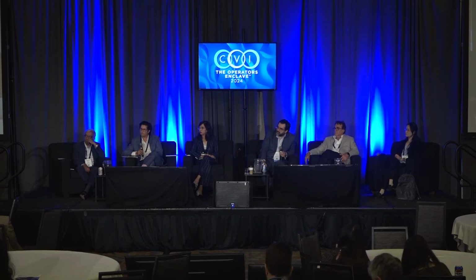Yeah, I think on distal anatomy first, it doesn't matter that much either for Watchman or Amulet, because ultimately those devices are deployed proximally, although you may require initially some more depth to unsheath the device. In terms of the outcomes, DRT has not been an issue because there's just so little surface area. With the seal, I think we have had some leaks, and we're still learning the best way to optimize that. The leaks with this are significantly different than other devices because we wrap the appendage. There's not really a lot of residual appendage volume.